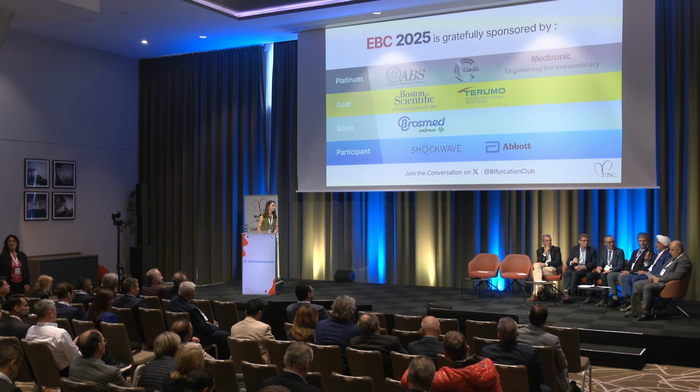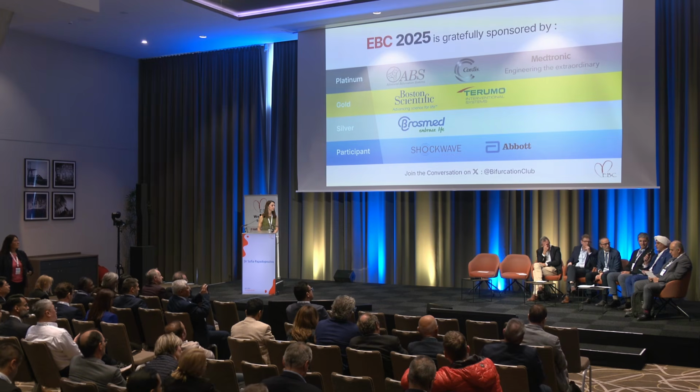Yes, so these are the eccentric nodular thick calcium. I usually do orbital in these scenarios, even if orbital is not enough. You use it first. If you use orbital or shockwave, I think the combination in these kinds of cases is very, very important, because I do orbital a lot in these scenarios and balloon still doesn't fracture all those areas.